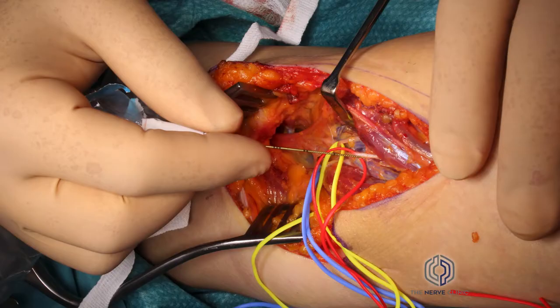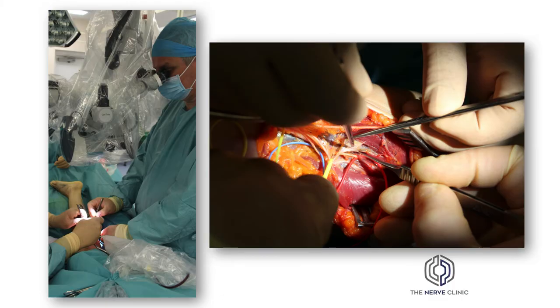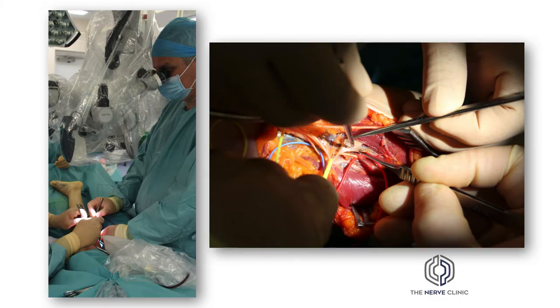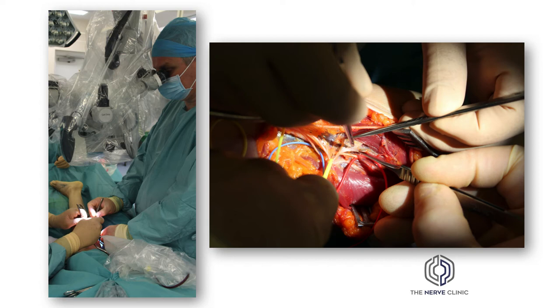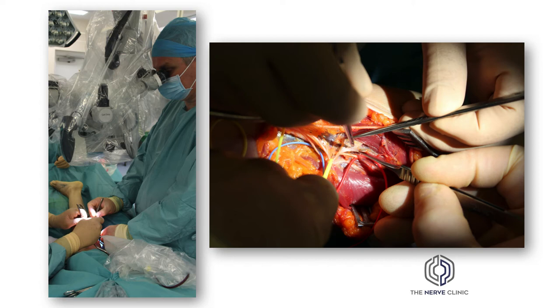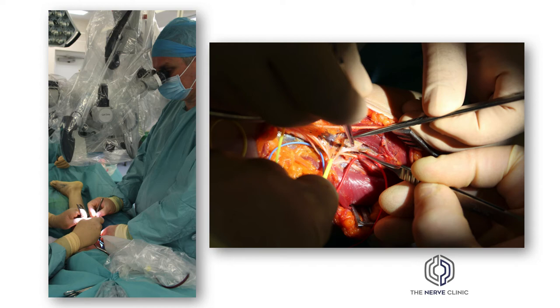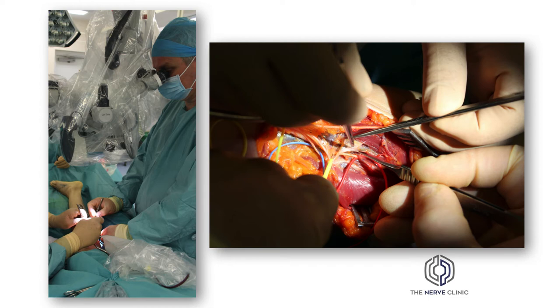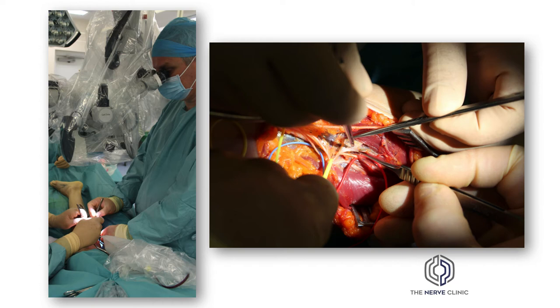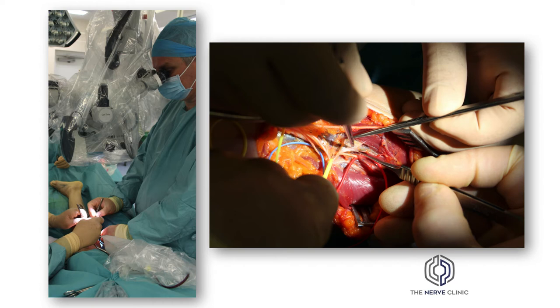After the individual nerves are mapped, they are traced distally towards the muscle and then under the operating microscope each of those individual branches is dissected to reveal a number of branches supplying different parts of that muscle. Selective neurectomy involves sectioning some of these motor branches in order to reduce the tone in the muscle without causing irreversible paralysis of the whole muscle.